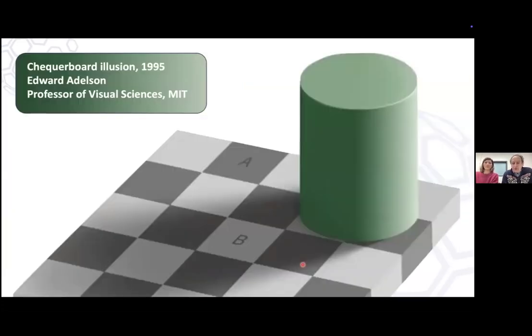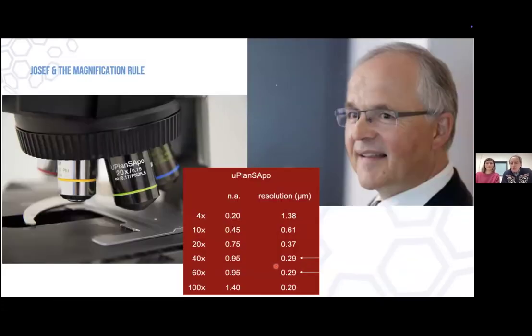Okay, so let me show you something else, why I think you need to understand this magnification rule and the resolving power. Because you see, you could even use higher power, but originally in the paper, he was using ×40, but several years of experience with PD-L1 has shown us that we need to be careful about using very high magnifications.